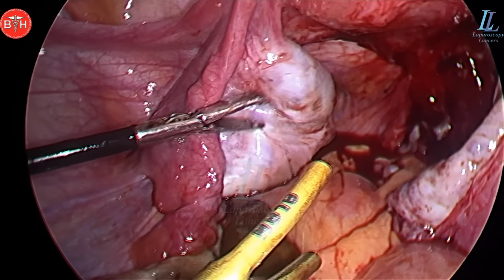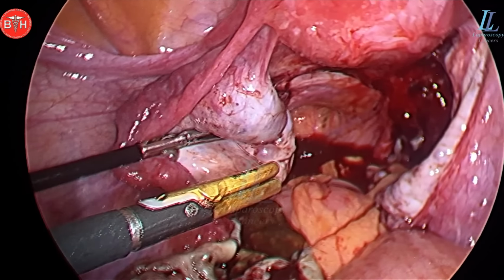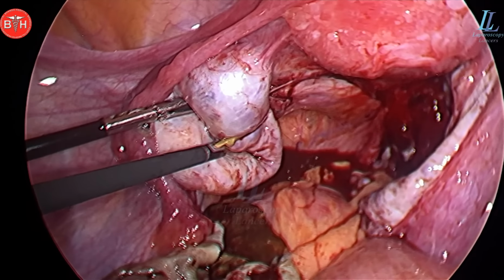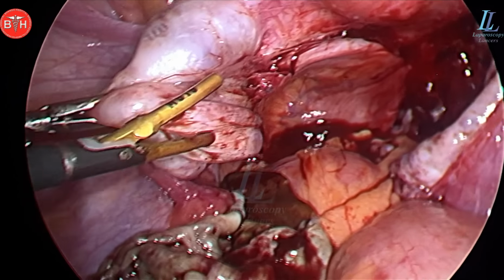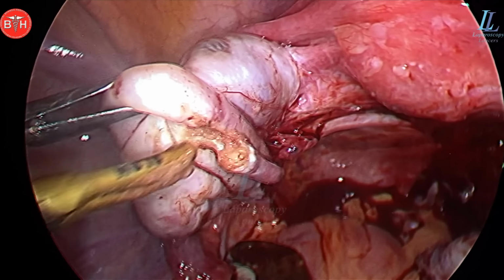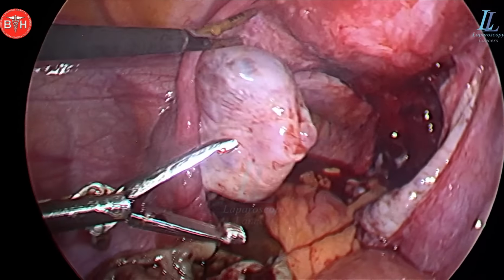So that's the left ovary. I have aspirated it. The chocolate fluid has been aspirated. Now the thing is to take out the cyst inside it, and again we'll be saving this ovary, as saving is more important. You should not do a drastic surgery over there, just opening the thinnest part of the cystic structure that I had seen.